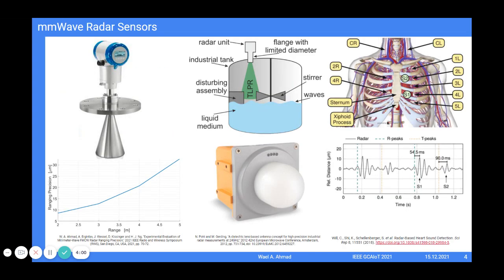Let's get started. Millimeter wave radars are now emerging in our lives in multiple domains and many applications. For example, measuring microdoppler vibrations or measuring range with very high accuracy. Here, for example, at 2 meters, we can measure this range with an accuracy better than 10 microns. This might be very useful in metal machining, where the cutting depth can be measured remotely by the radar.